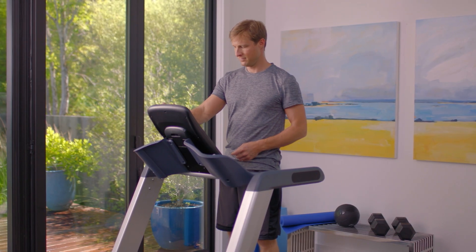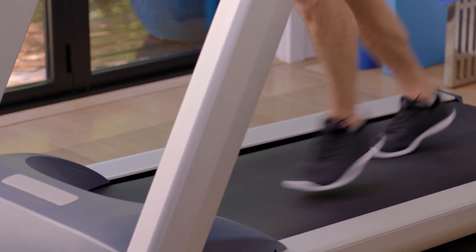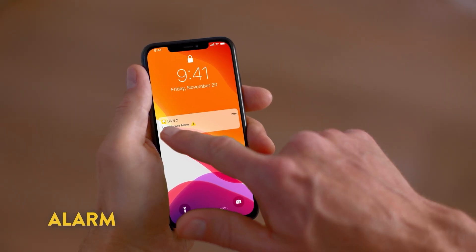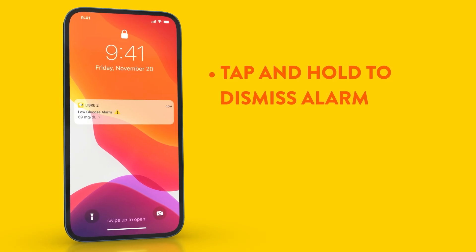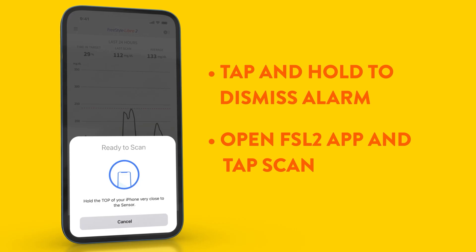Make sure you have the Freestyle Libre 2 app running in the background, otherwise you won't receive glucose alarms. When the alarm presents a notification on your phone, just swipe to open the notification and then scan the sensor with your phone to see your current glucose reading. Alternatively, you can tap and hold the notification until you see the option to dismiss the alarm, then go to the Freestyle Libre 2 app and tap the scan button.